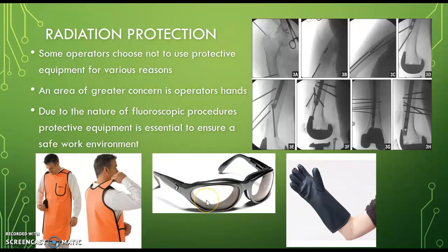Next is the lead glasses or goggles. Those are worn by medical personnel during fluoroscopy procedures to protect the sensitive tissues that are the eyes.